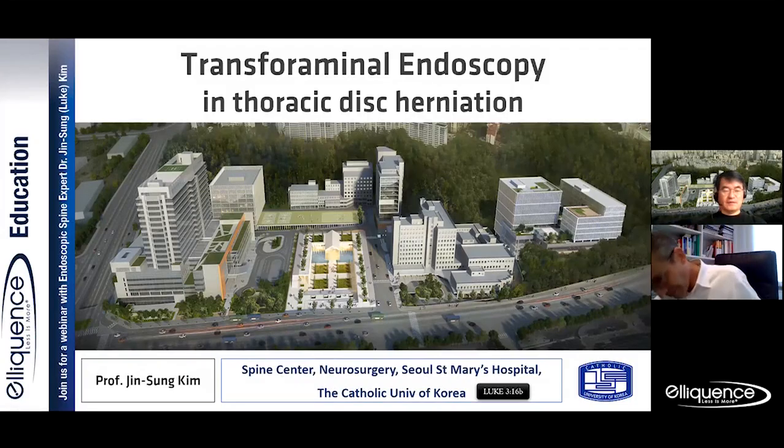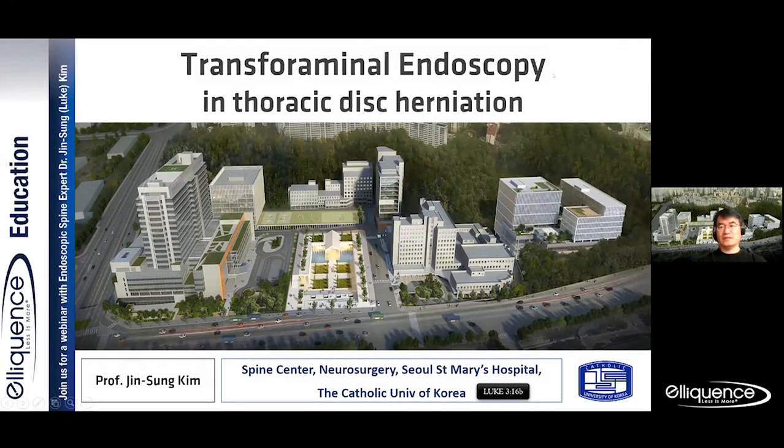Today, I'm going to talk about transforaminal endoscopic spine surgery in thoracic disc herniation. Recently, we have been surprised to see the dramatic adoption and more and more uses of the spinal endoscope taking place a lot. And also tons of evidence papers and presentations are coming out every day.